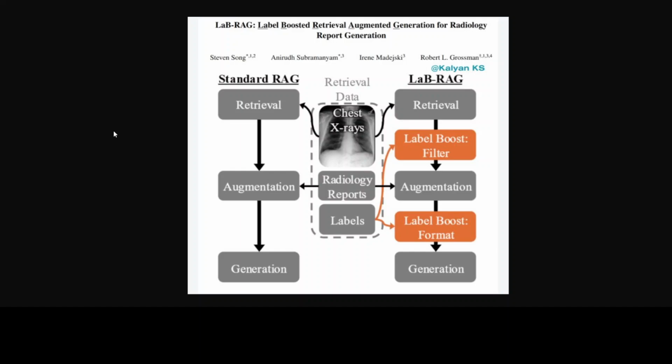Whenever a radiologist or anyone asks a question about the patient, about their radiological data, then that question is converted into a numerical representation, and then a similarity search is made in that vector store for the similar radiological data, and then that returned similar data is augmented with that prompt and given to the LLM, and that is how the LLM has a more grounded response as per the patient's own data. That is the whole idea behind it.